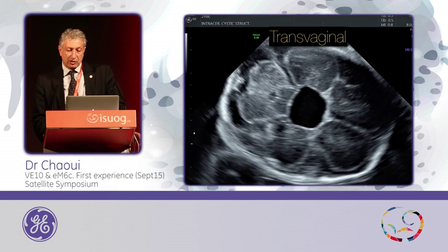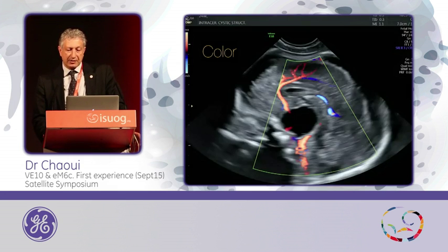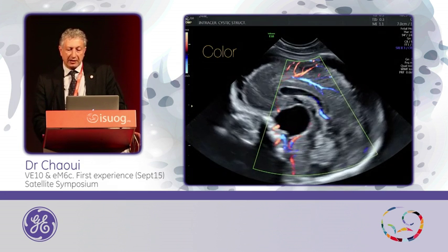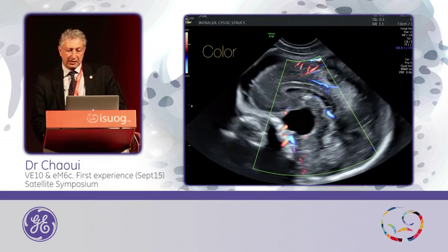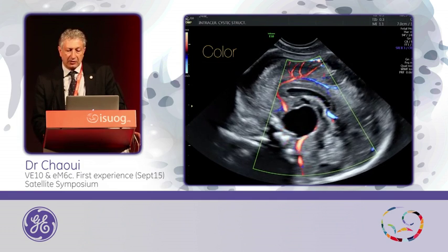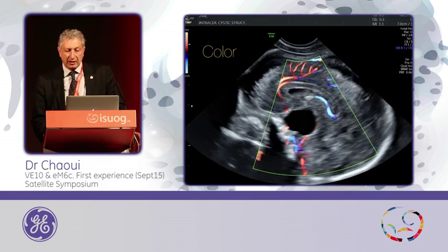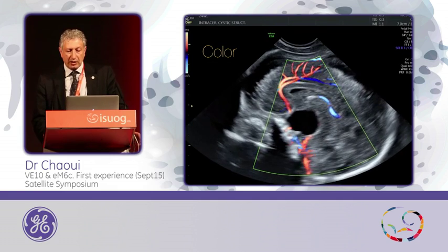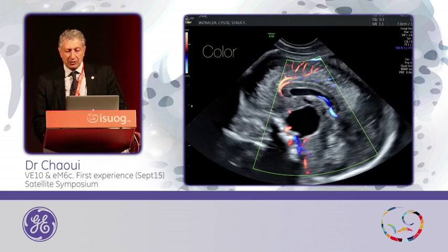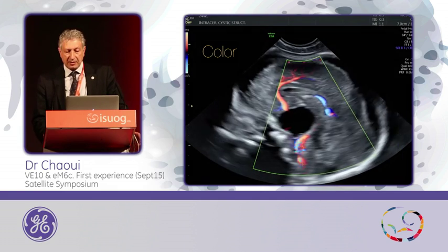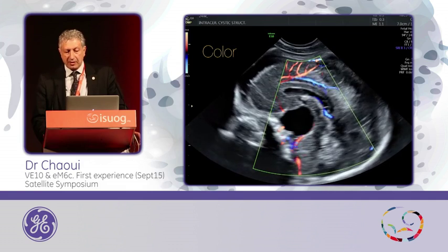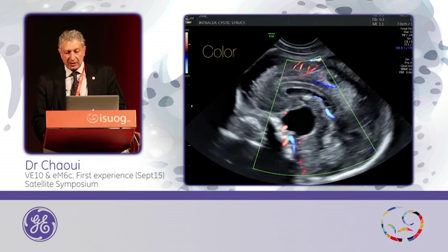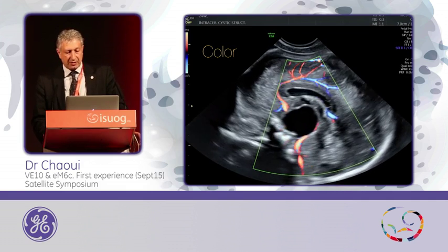Then moving transvaginally to see the appearance and adding color Doppler to see the vessels surrounding — and you see here that you can clearly see the two pericallosal arteries present in this fetus. You see the internal cerebral vein.